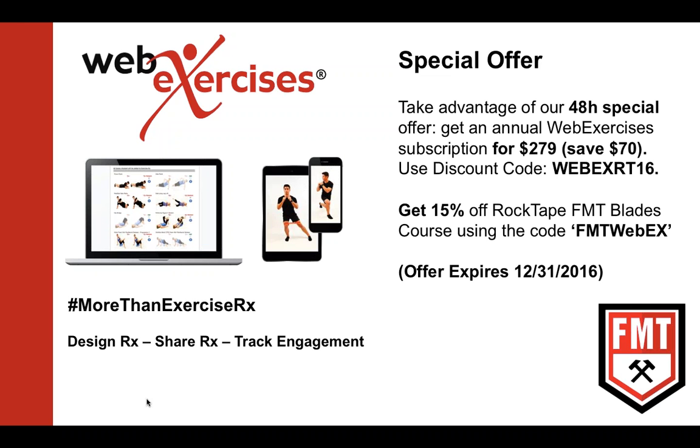Great question. So I don't typically tool extremely hard over any hardware. I wouldn't tool directly extremely hard over any thrombuses. If you know that patient has a thrombus in that area based on seeing their physician, I wouldn't tool directly over a thrombus. I still haven't seen much of the research on tooling over varicose veins. That's something we could look further into. But other than that, as long as I'm not inducing too much pressure, again, this is more neuro, I think that the contraindications are rather small.